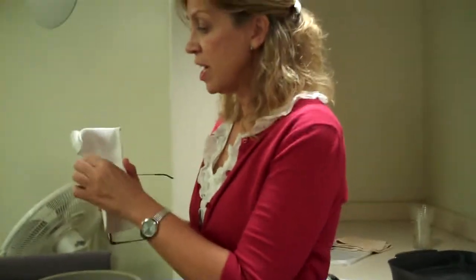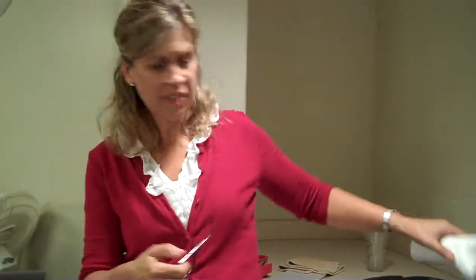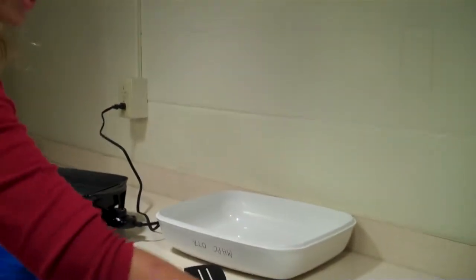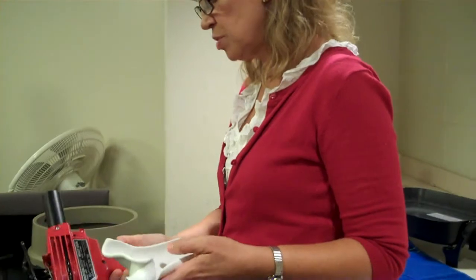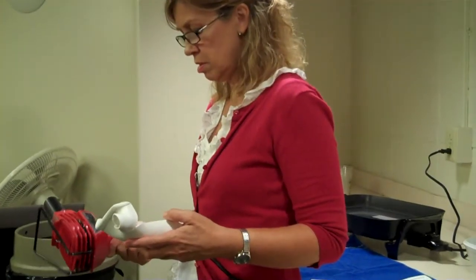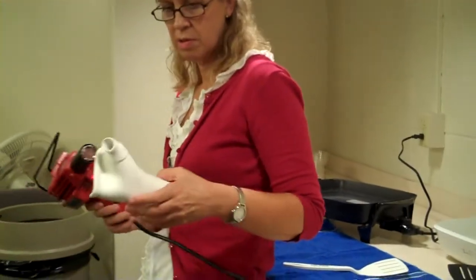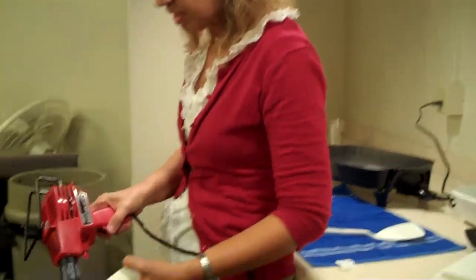This area that I tried to cut made some jagged edges, that's where I'd probably use the heat gun, because I'm not going to be able to get that in there very well. So that's where you want to get your heat gun and spot heat a few areas. These get really hot, and don't tell patients they can use their blow dryers, because it really doesn't work. You just want to keep it moving in that area like this.